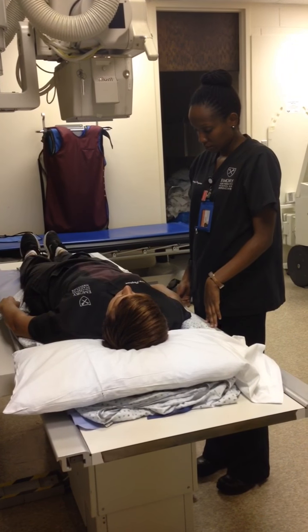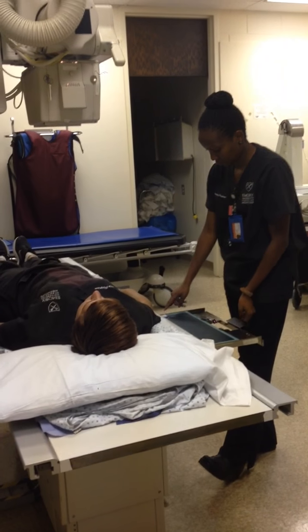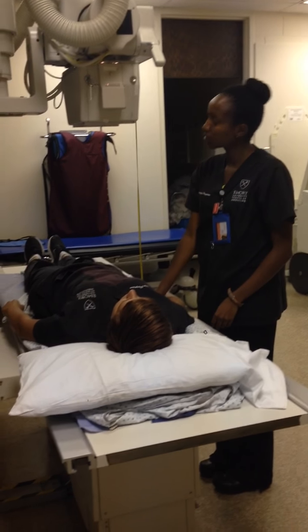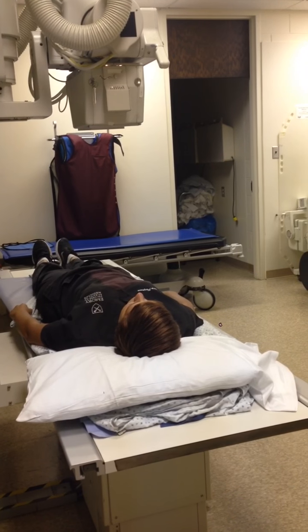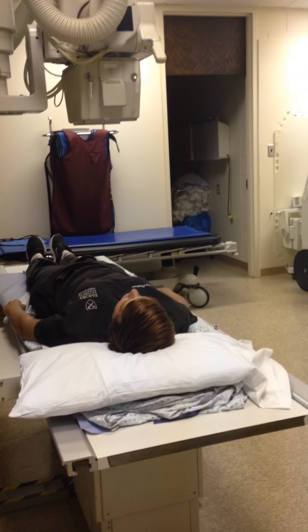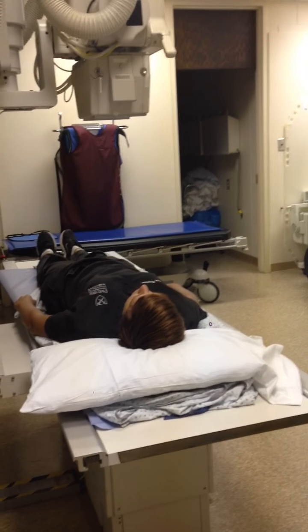Place the marker to the patient's anatomical side, either in the collimated field or in the cassette. The source to image distance is 40 inches. Lastly, the technical factors will fall between 90 and 100 kVp with air and 110 with contrast. The mass will be between 8 and 10. Instruct the patient to suspend their breathing at the end of expiration.